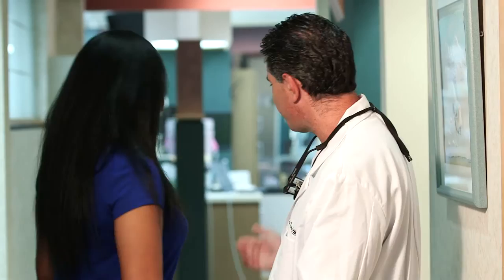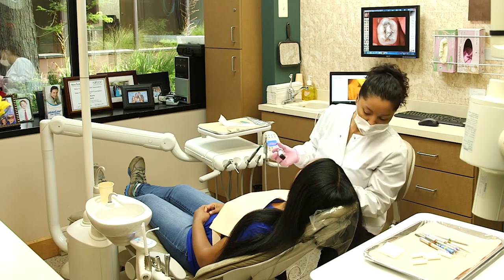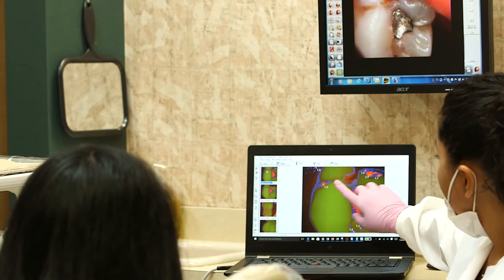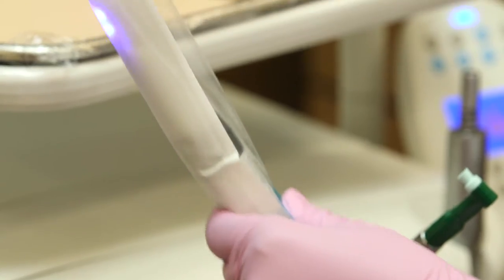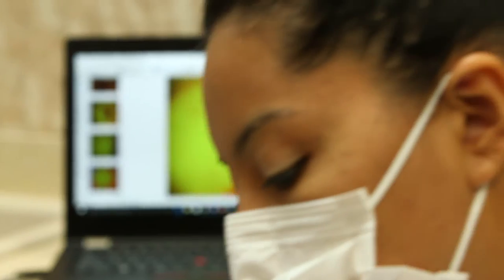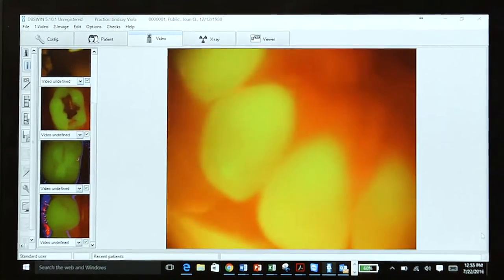Now you're probably wondering just how Spectra works. Today we have a patient ready for an examination — this is Lauren. Most of the time Spectra is used during your hygiene visit, after the hygienist has finished cleaning and polishing your teeth. First, Spectra is placed in a hygienic sheath — a new sheath is placed on Spectra before each examination. Then a sterile spacer is placed on the tip of the Spectra, which enables it to stay at the proper distance from the tooth to capture consistent, accurate images.